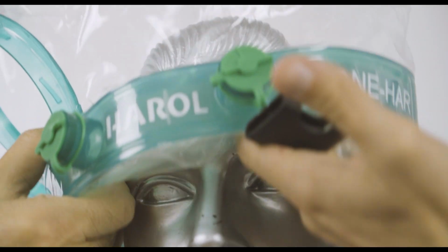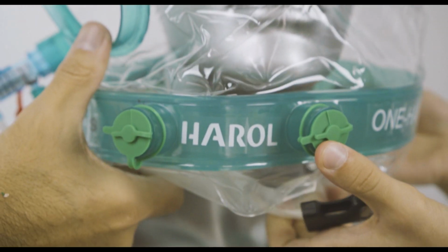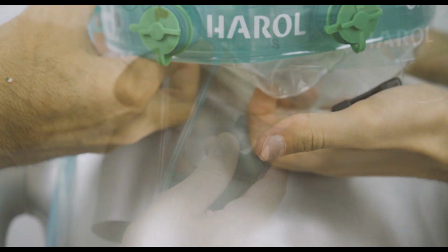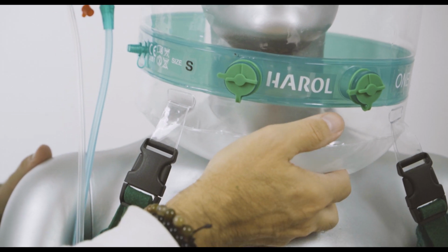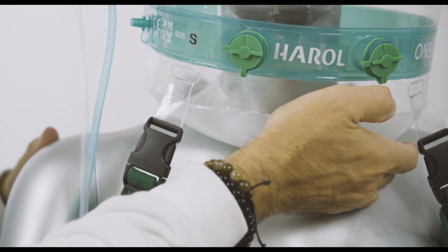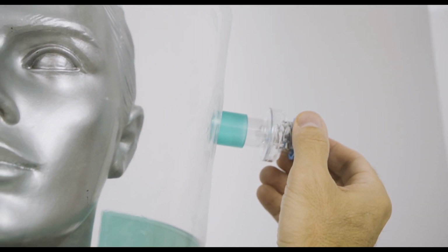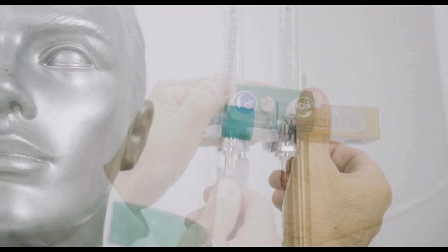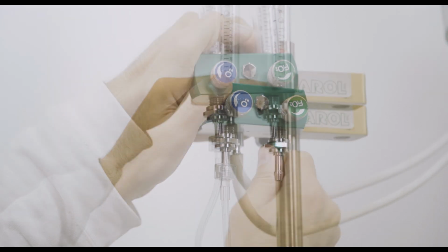With the help of a second operator, widen the collar as much as possible so as to pass the patient's head without impediments. Connect the suspenders. Close the porthole. Check the tightness of the helmet by placing the collar on the upper part of the chest and, if necessary, tighten the straps. Set the PEP valve to the desired value and adjust the flow meters following the table to set the desired FiO2 according to the set pressure.